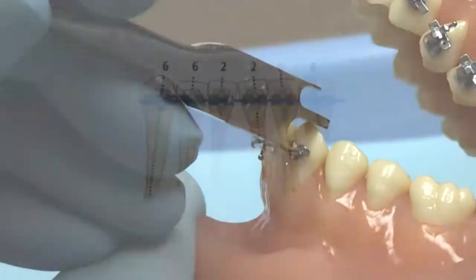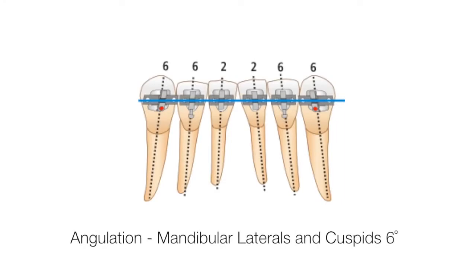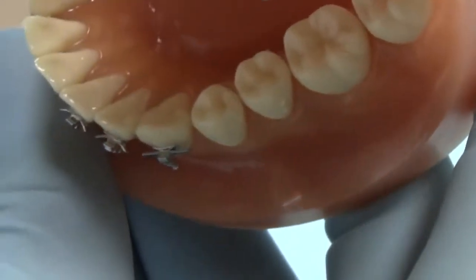Regarding angulation on the lowers, the central incisor is 2 degrees and the lateral and cuspids are 6 degrees. Again, this spreads the roots apart properly and is a big factor in the long-term stability of the 6 anterior teeth.